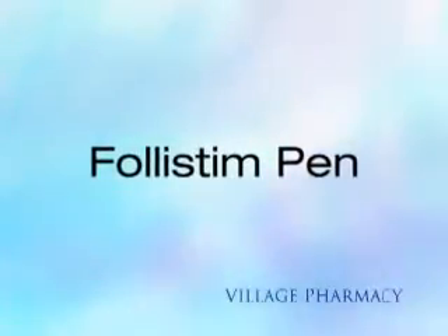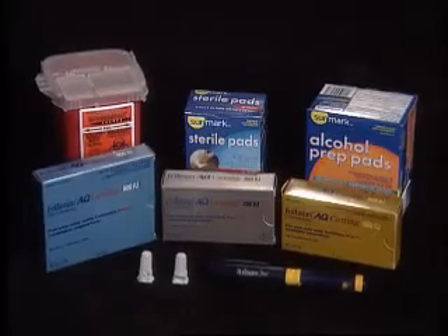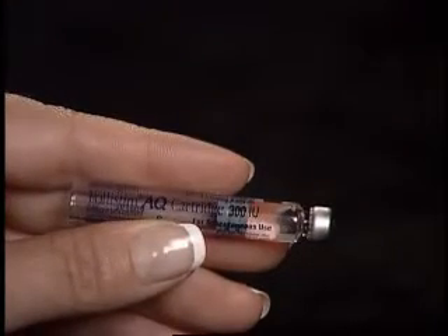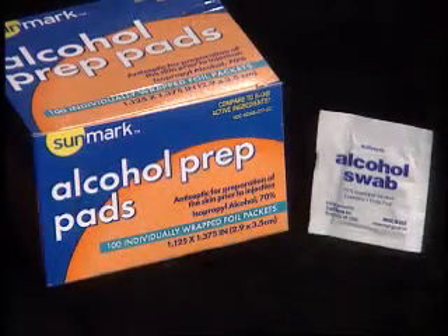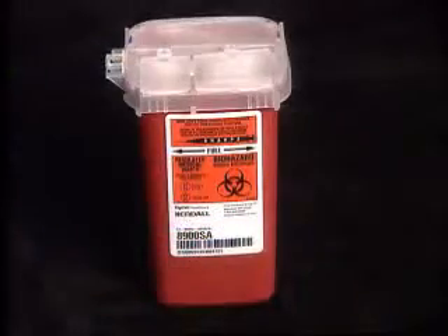You are viewing the Village Pharmacy Med Series for Follistim Pen. The supplies needed are: Follistim Pen, Follistim AQ Cartridges, BD Microfine Pen Needles, Alcohol Wipes, Sterile Gauze Pads, and a Sharps Container.